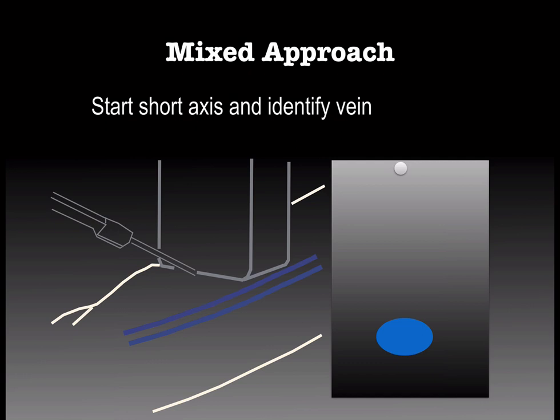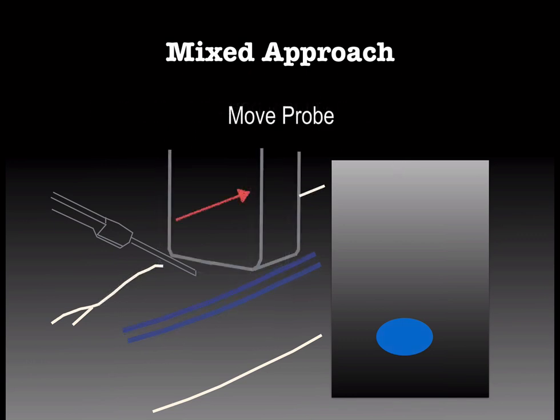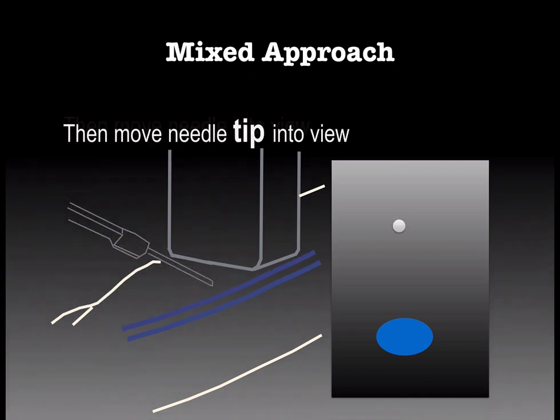So with this mixed or combination approach, we're going to start in short axis with the needle at the top of the screen, our vein lined up, and we're going to move the probe. When we move the probe, the needle's going to disappear. Now we're going to move the needle. When we move the needle, it's going to pop into view. When we see that needle tip, we know it's the needle tip because it's the front of the needle. We stop moving our needle.